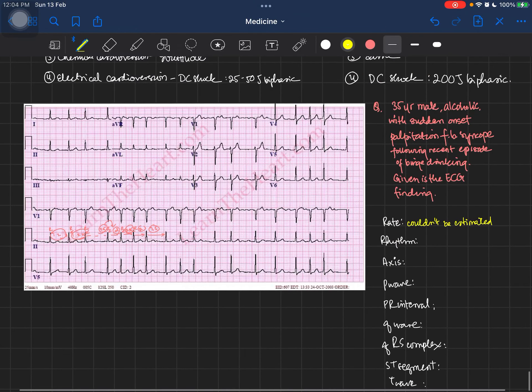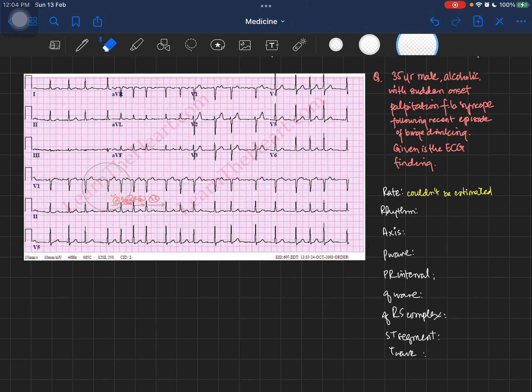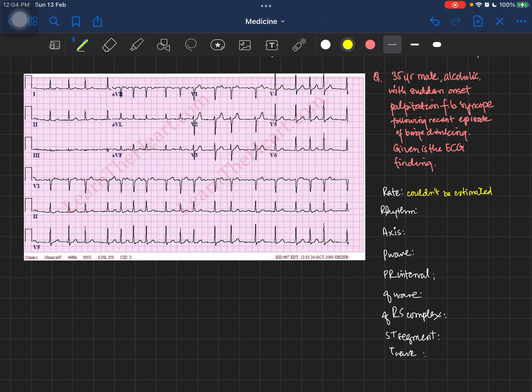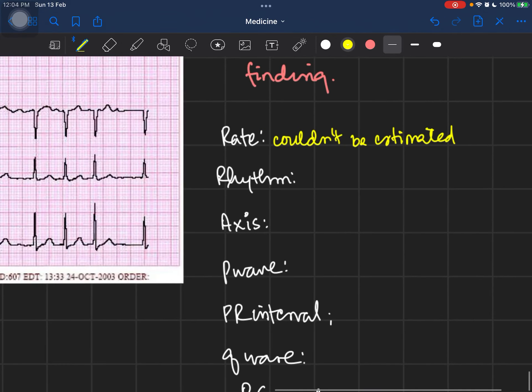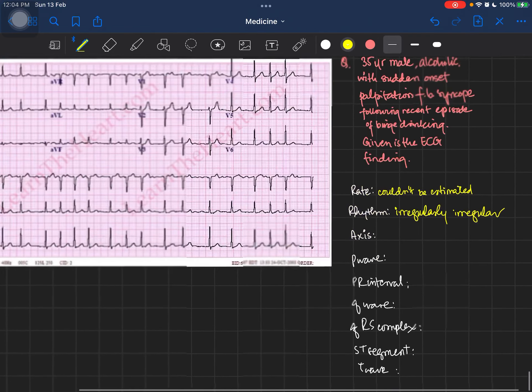There are ways to determine heart rate in atrial fibrillation, but this video is focused on teaching you how to identify an ECG of atrial fibrillation in an exam scenario — whether a viva or a spotter. You may not have all the time to calculate everything, so you can simply state that the rate could not be estimated because the rhythm is irregularly irregular.